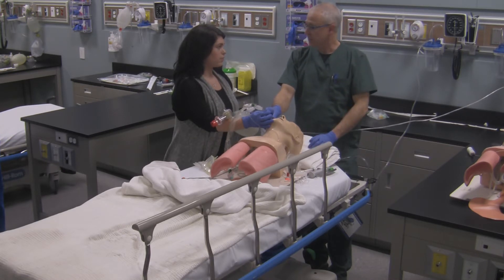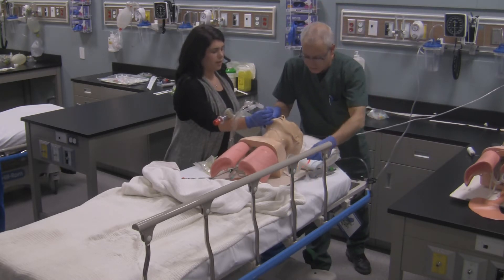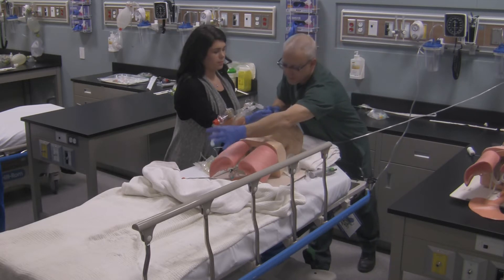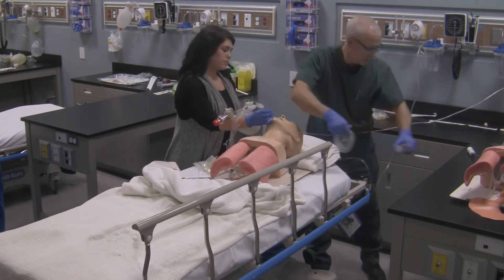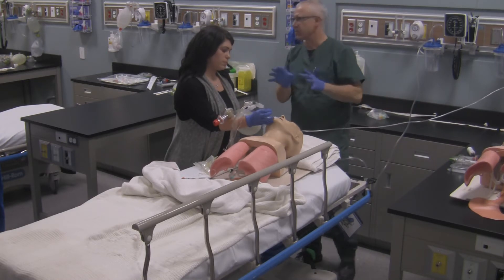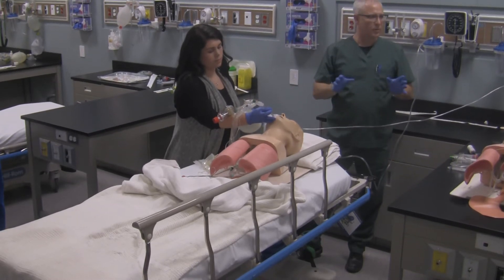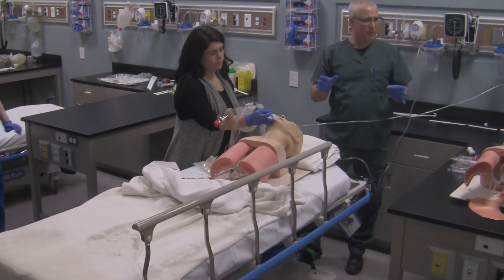We're going to tape the tube in place now. When you're taping this tube in this lab period, tape without gloves on because it's a lot easier to do the taping. This isn't an evac tube, so you don't have to worry about the evac catheter, but you've got the pilot balloon line here as well.